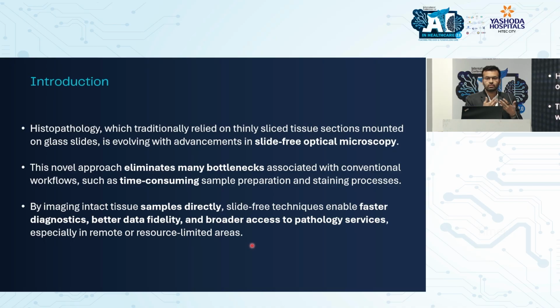For example, one of the technologies uses ultraviolet imaging to excite the cells. Each cell has got different features in it. Like for example, nucleus has got different excitation, cytoplasm has got different excitation, right? So you have a scanner which captures all that. You have a camera which captures all that, converts it to a digital image, which you can then view. Which means the entire process is finished in about 10 to 15 minutes, and your tissue is still intact.